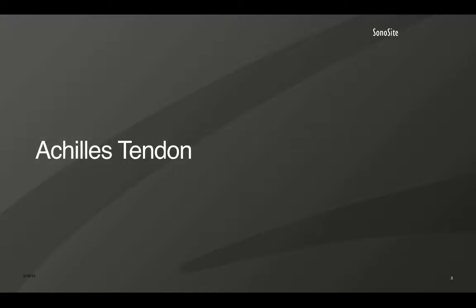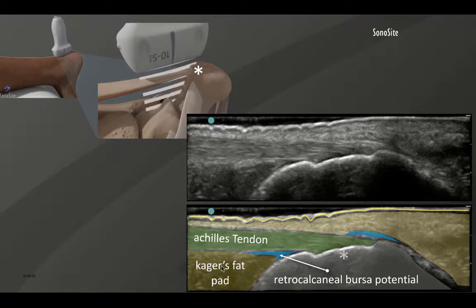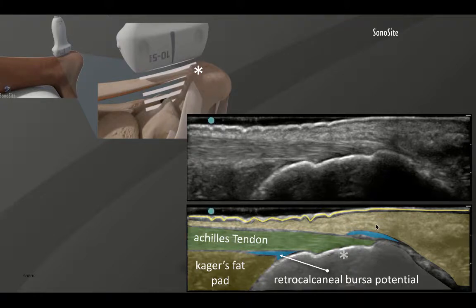We'll start off with the Achilles tendon in the posterior ankle. It's very easy to ultrasound because all of the tendons are very superficial and longitudinally oriented, and the tendon enthesis is very superficial and shallow, making it very easy to appreciate where the tendon is inserting. Other landmarks here are the Kager's fat pad and the retrocalcaneal bursa. Not mentioned here is the retro-Achilles bursa, which sits just superficial to the enthesis of the Achilles tendon and deep to the fatty tissue on the posterior part of the heel.